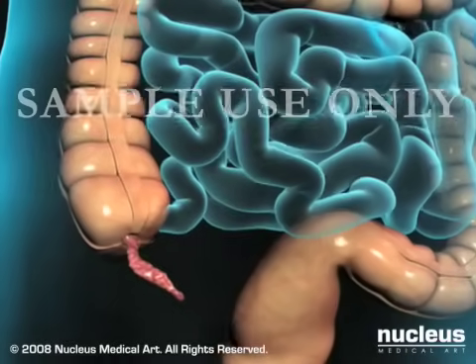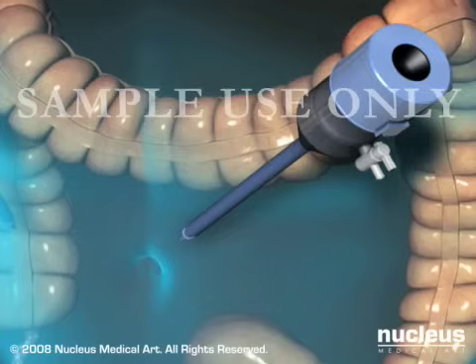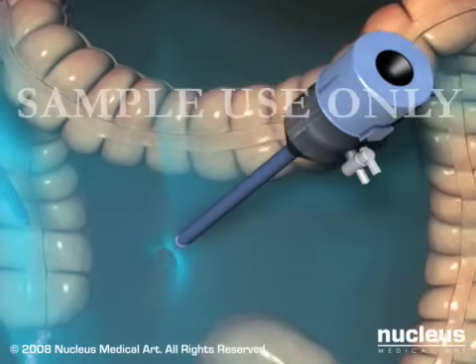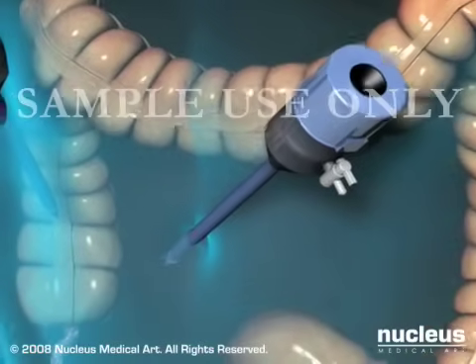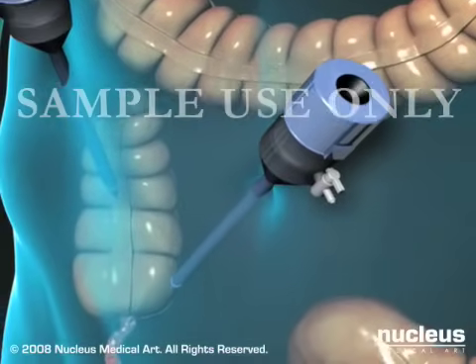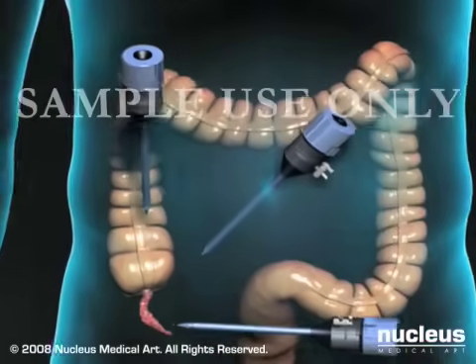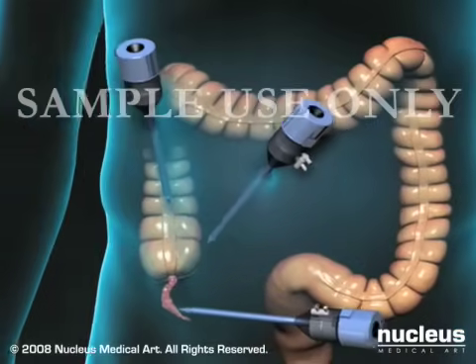An uncomplicated laparoscopic appendectomy usually takes between 20 and 30 minutes. To gain access to your appendix, your surgeon will use sharp instruments called trocars to create three small holes or ports through your abdominal wall. These ports are usually located at your navel or umbilicus and in the upper right and lower left quadrants of your abdomen.